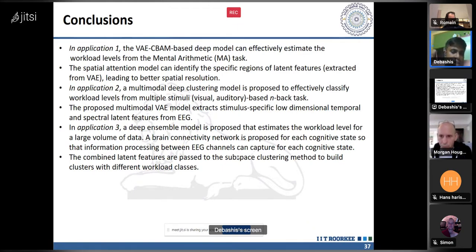Maybe what are the results? The result, he can imagine in his mind. And after that, whatever the result, it may be 350 or something like that. Then the participant is asked to subtract one digit from this every time within 2 seconds. So 350 minus 1, 350 minus 2, 350 minus 3, like that, he has to remember this. So this is a task state. So irrespective of your arithmetic task, this entire experiment is different.